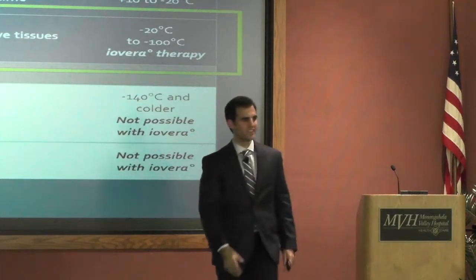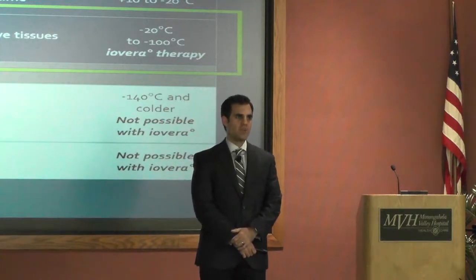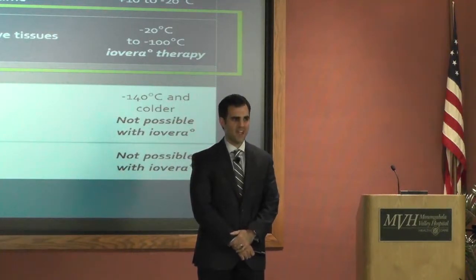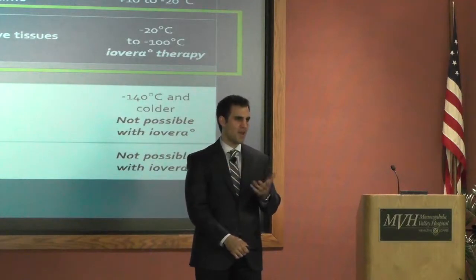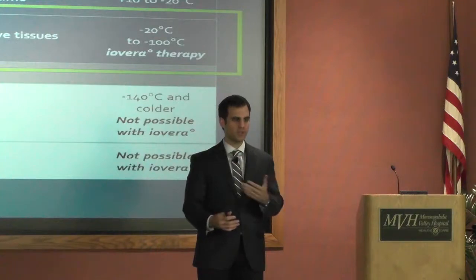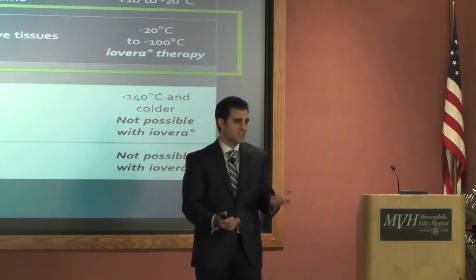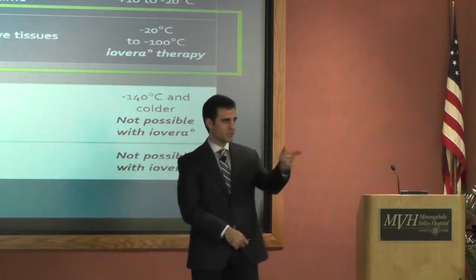How about feet? It probably can be used. I wouldn't be the one. It would have to be someone that would do it more often. I feel very confident in doing this for knees, for somebody that has knee pain, but feet probably could be used for certain conditions. I'm just not sure off the top of my head.